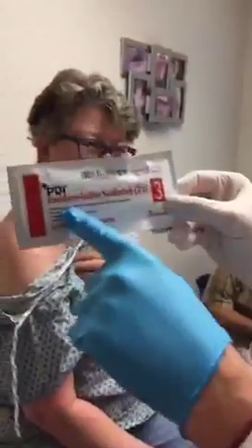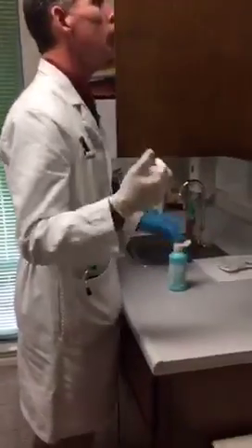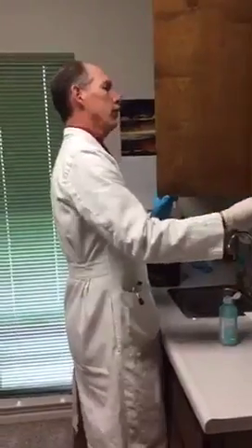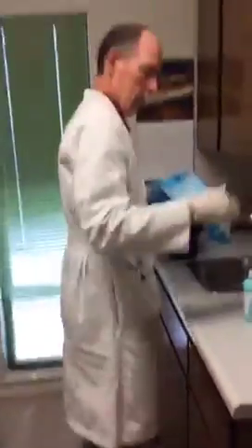Share the hurt. So we're going to use some iodine on a swab stick to. Iodine? Oh, you can't have iodine. Can't have iodine. That is correct. We will not use iodine. Don't break out. We'll use Hibiclens. And the Hibiclens, I need to get some sterile. Do we have any sterile gauze in the rooms? Oh, I just cleaned some. There you go. There it is. Okay.